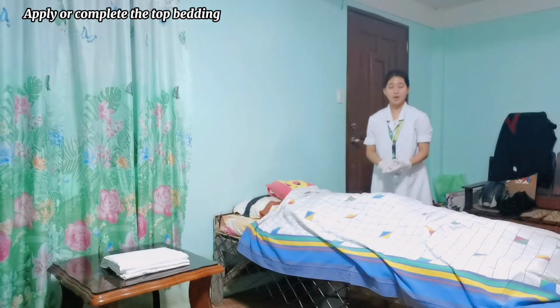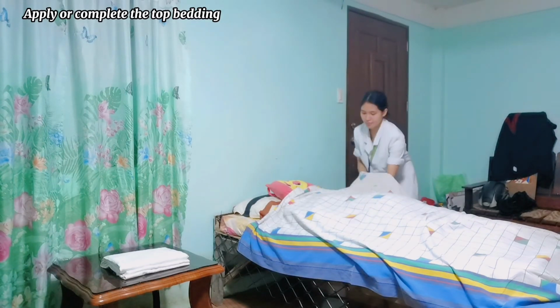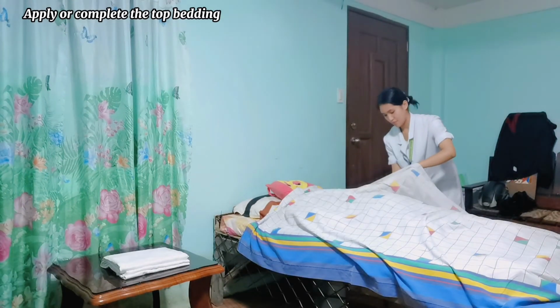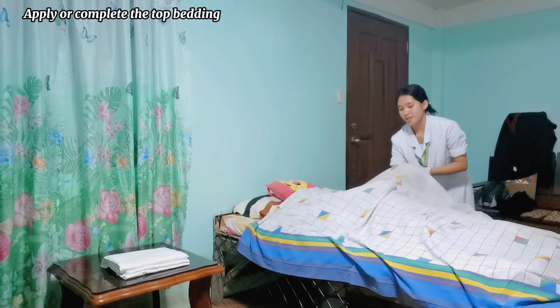And then we will remove the bath blanket. Ensure the client's privacy.